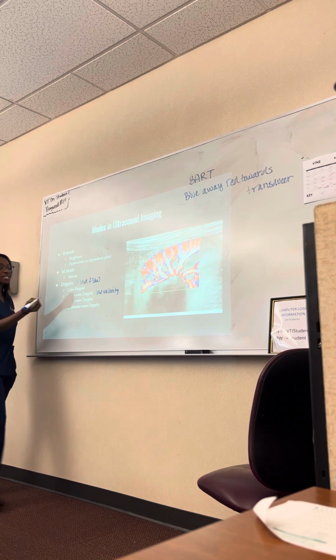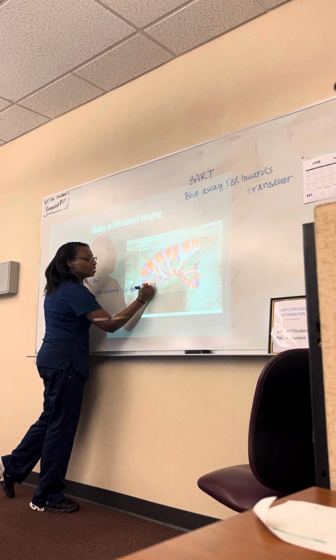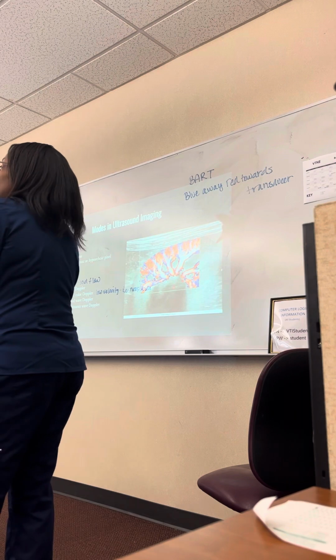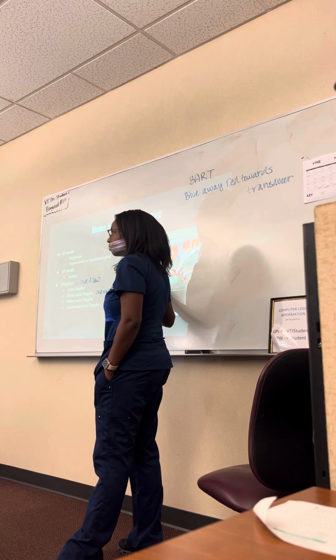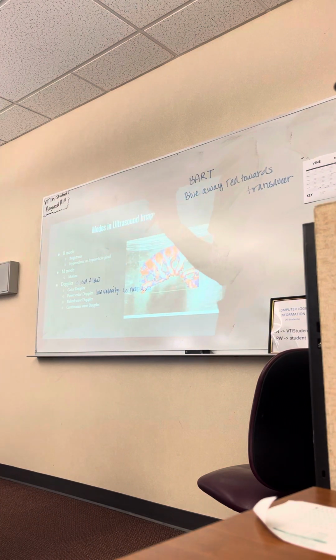So for instance, this would be used if the vet maybe suspected a neoplasia, right? Because we know, what does neoplasia mean? New growth. So typically this might be a benign or a malignant tumor, right? We know that it has to have some blood supply, because it's a tissue. There has to be blood supply to this tissue, but it's not going to be a high velocity blood supply, okay? So basically what we're doing is confirming that in fact this is a neoplasia. Okay, low velocity, low blood volume in that area.